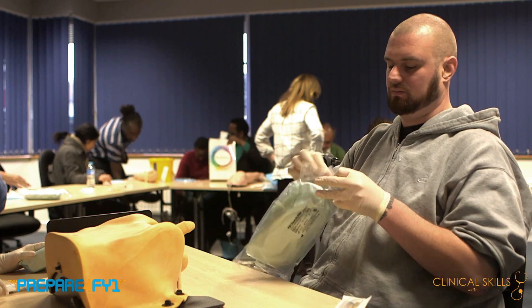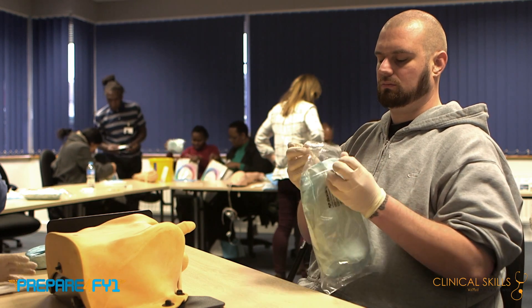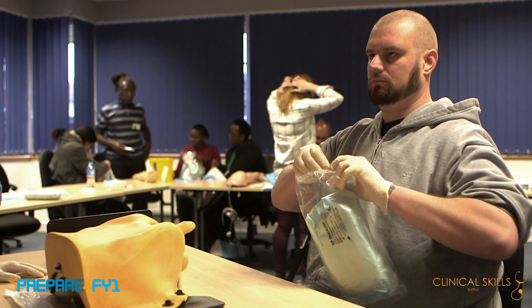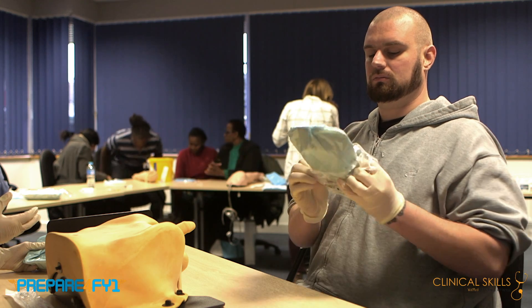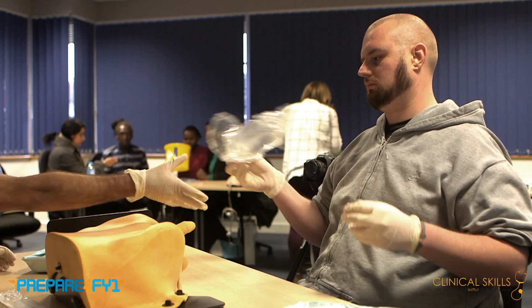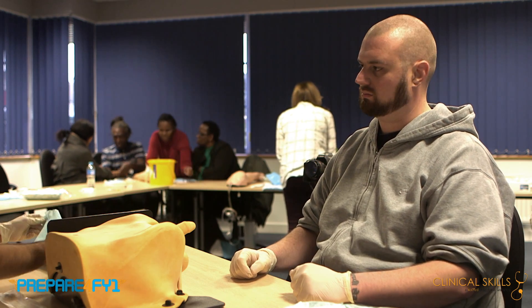We've already opened the first bag. Gary, if you just open that one for us now in the way that we've shown before. Hold the back of the bag, and then without touching the inside, just pop it down. When you're opening these bags up, it's the blue bit you touch — only the blue bit.